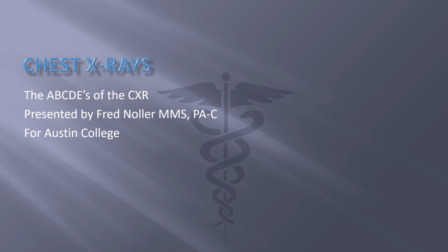And there's a system that I use that I think will be beneficial for you as it has been for me to navigate a chest x-ray to get the most information quickly from the study that you ordered. I use the technique called the ABCDEs of the x-ray. So I'd like to share that with you. So we'll move along here.